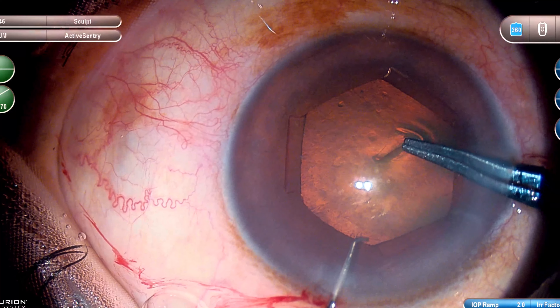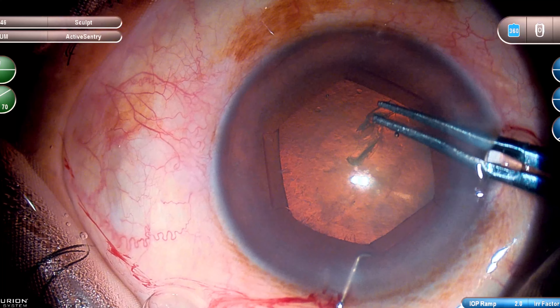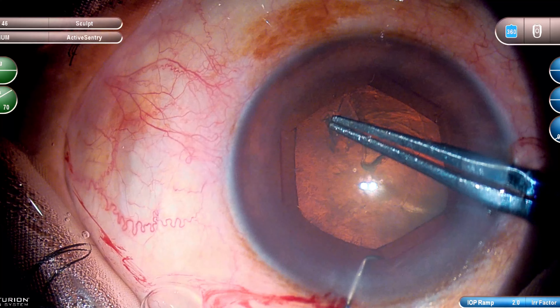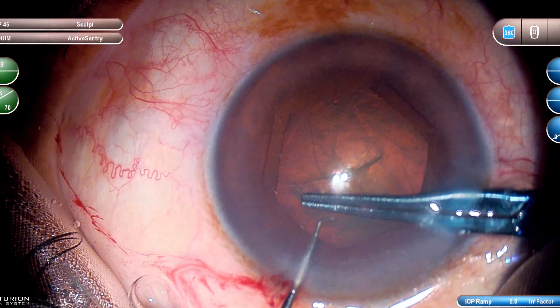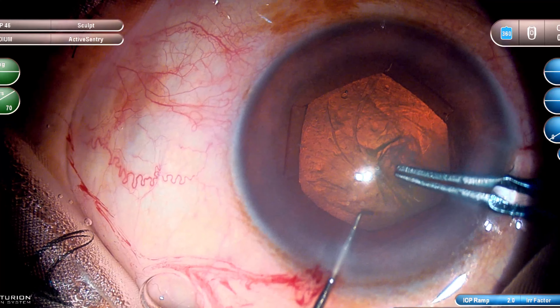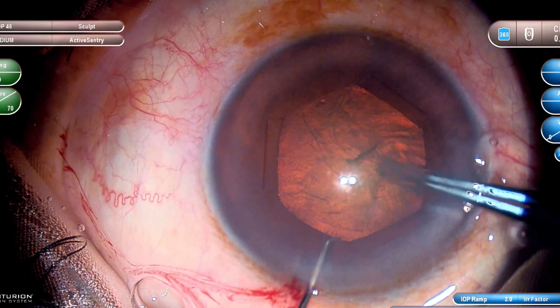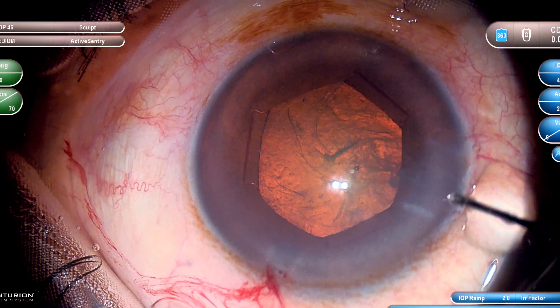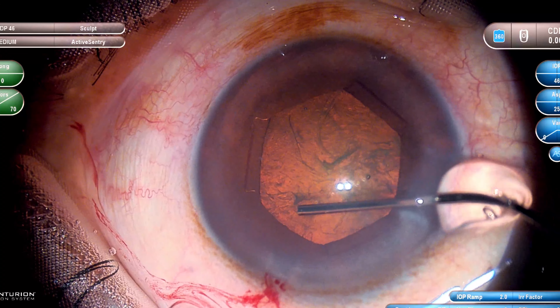Now I am going to use the Innamura Capsulorhexis forceps. I have recently started using this — I feel we get better control on the capsulorhexis sizing and centration with the forceps. I am going along the pupillary margin here. And this is the important part — the sub-incisional part — where we should carefully hold the flap, because if you don't hold it carefully it might extend there.